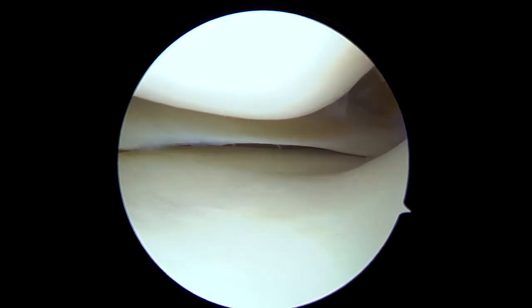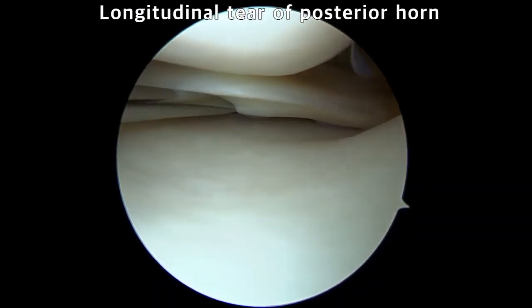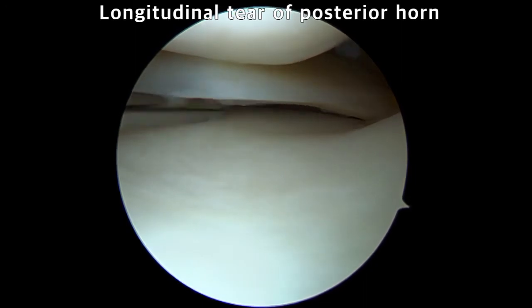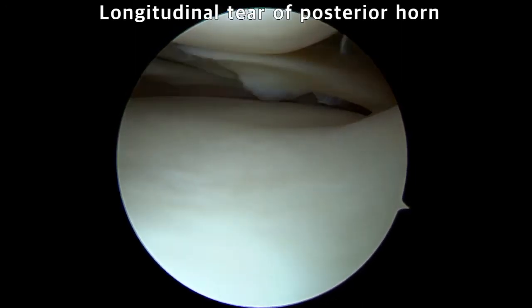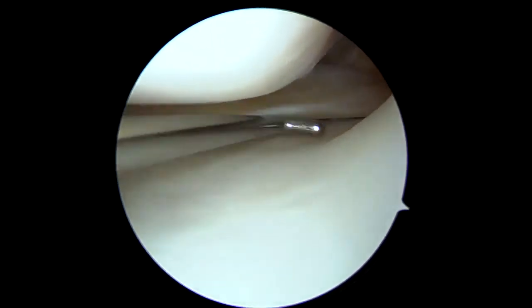Typically, by standard anterior portals, the ramp lesion is not fully exposed as it is covered by the medial femoral condyle, and sufficient space for repair is not secured. In this case, an additional longitudinal meniscal tear is observed. The probe from the anteromedial portal could examine the ramp lesion by pulling, but the medial femoral condyle blocks fine manipulation.